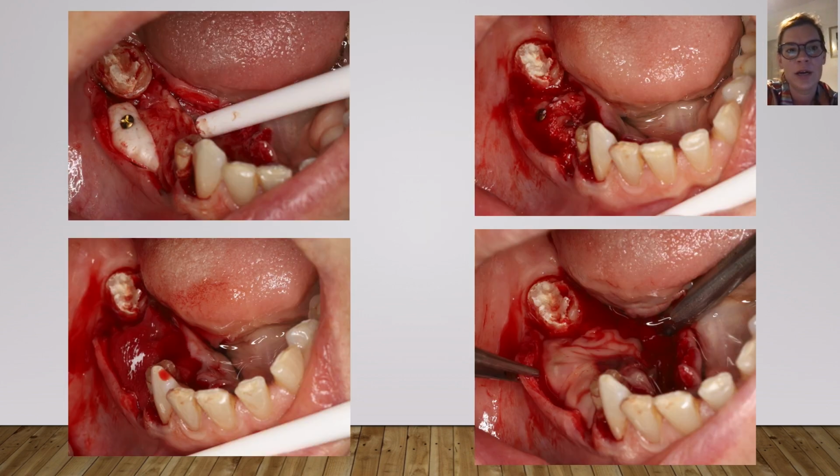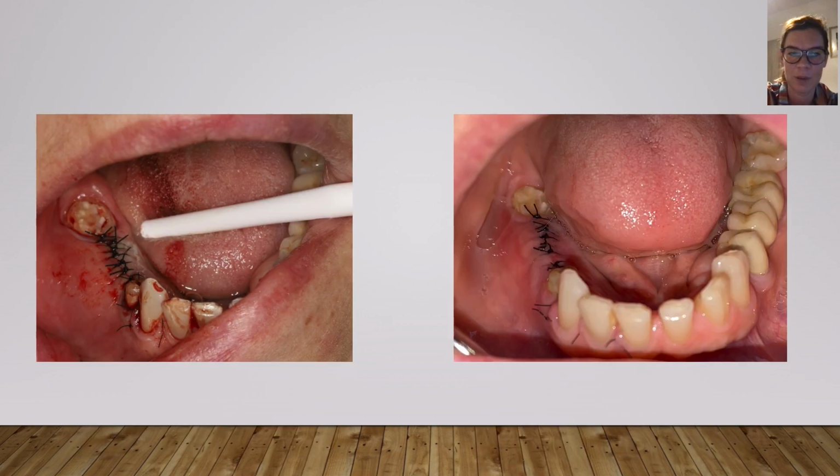So first I fixed the block on the buccal side of the patient, and after I filled the gaps and the other areas with this particulated own bone mixed with the PRF. After, I covered it with the collagen membrane, fixed by pins on the lingual and on the buccal side, and on the top of it I covered it with the PRF membrane.